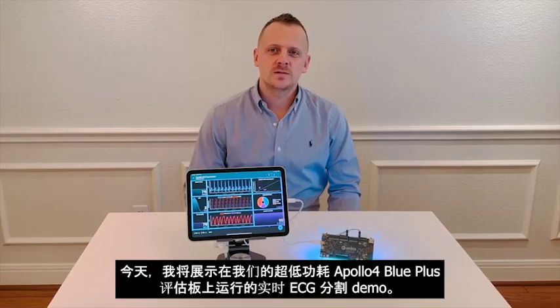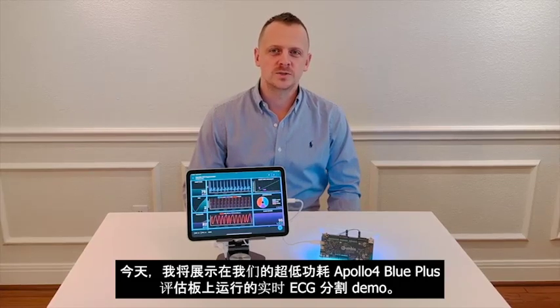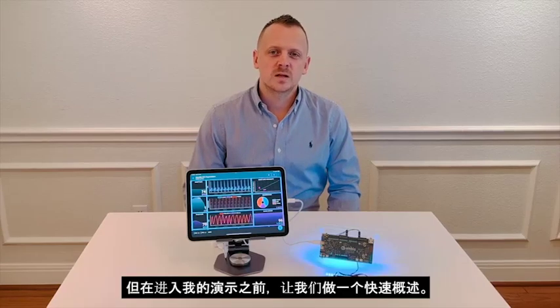Today I'm going to be showcasing our real-time ECG segmentation demo running on our ultra-low power Apollo4 Blue Plus evaluation board. This is a complete end-to-end demo showcasing running real AI workloads on battery-powered edge devices. But before jumping into the live demo, let's do a quick overview.